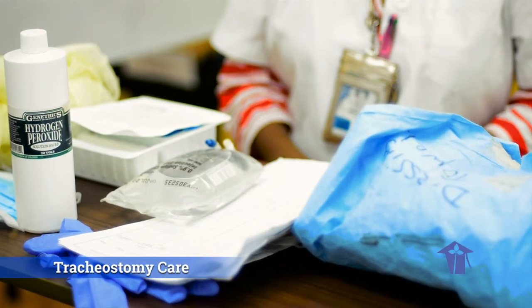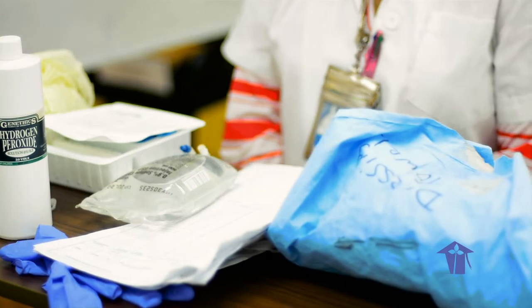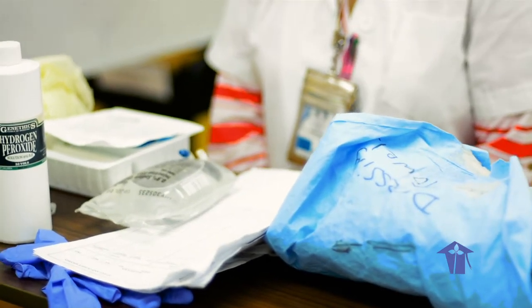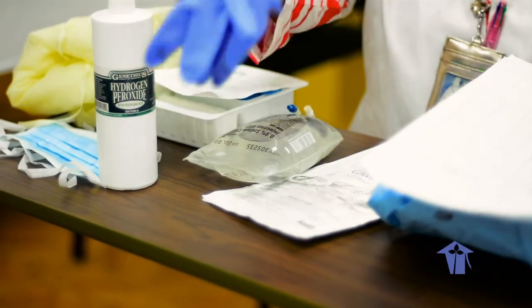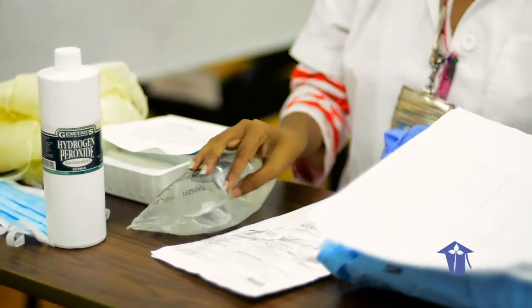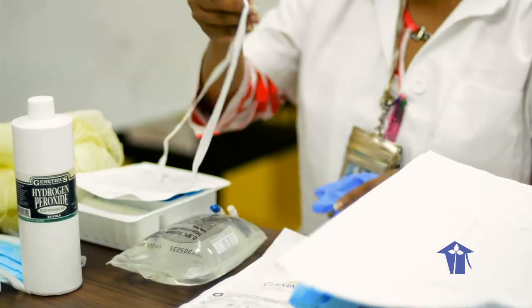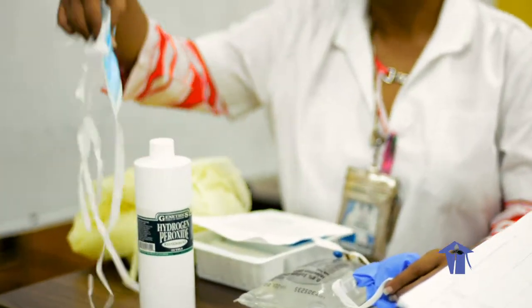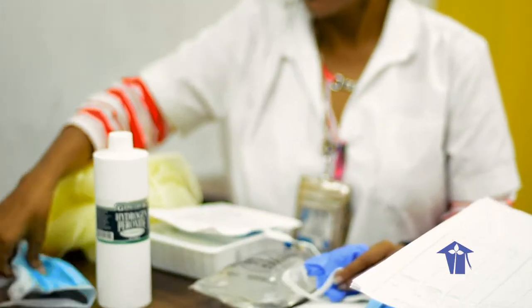Hi everyone. Today we are going to do tracheostomy care on a patient. So first we will gather our equipment. Our equipment is disposable gloves, sterile gloves, goggles and mask or face shield, additional PPEs as indicated.